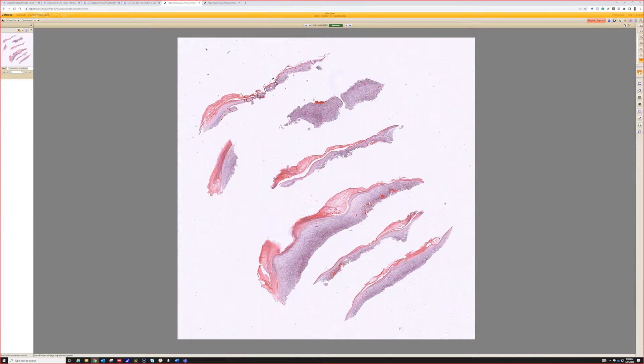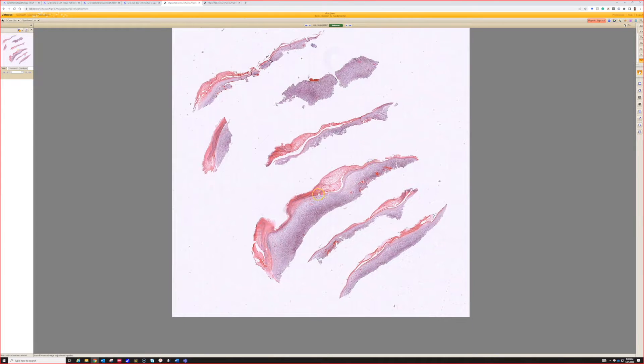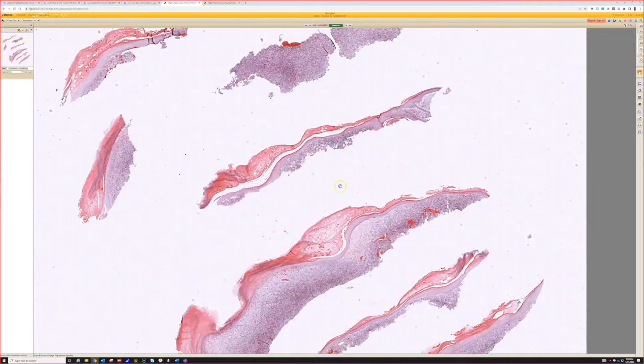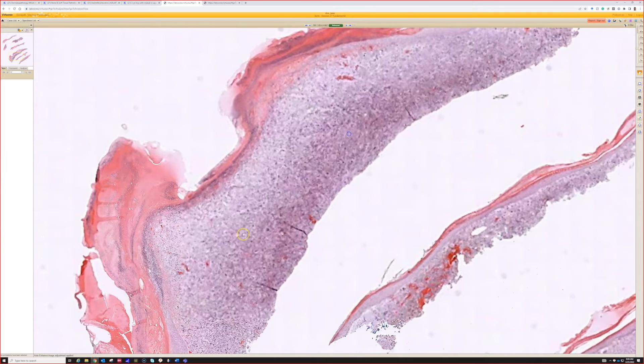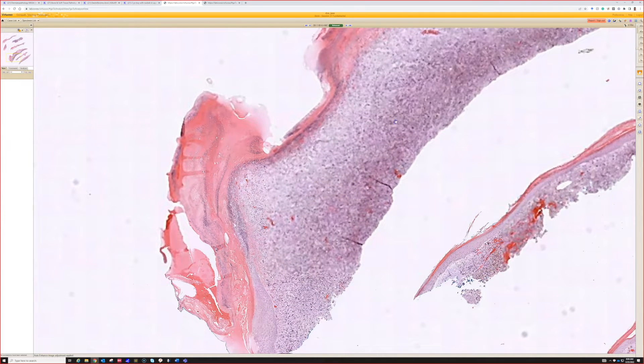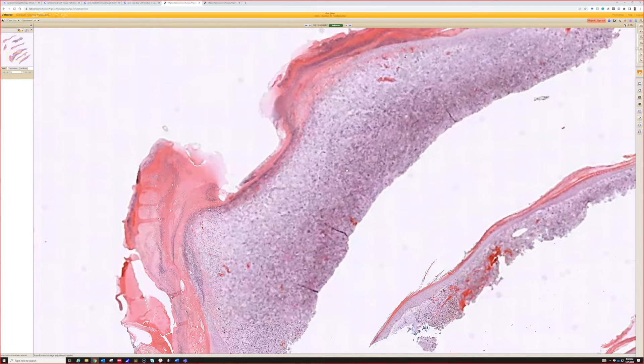Okay, now we're on to case 6. So I can take this. Okay, so we see kind of ulcerated skin here with crust. Good. And a lot of inflammatory cells below it.